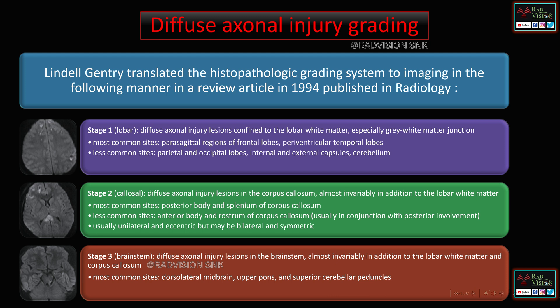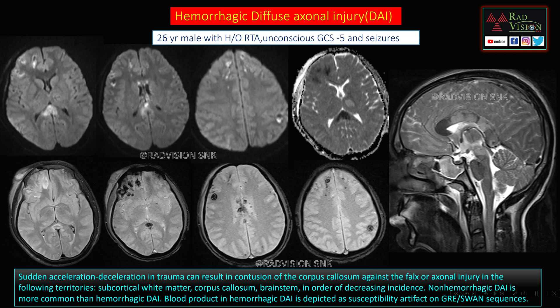Another case: 26-year male with history of RTA, unconscious, GCS 4 and seizures. Restricted diffusion on DWI in the splenium of corpus callosum and subcortical white matter of bilateral frontal lobes with low ADC values, and blooming on GRE within the lesions — a classical case of hemorrhagic DAI. Sagittal sections of the corpus callosum show diffuse edema and injury sparing the genu and rostrum. SWI and GRE/T2-star sequences typically depict hemorrhagic DAI and differentiate it from non-hemorrhagic DAI.